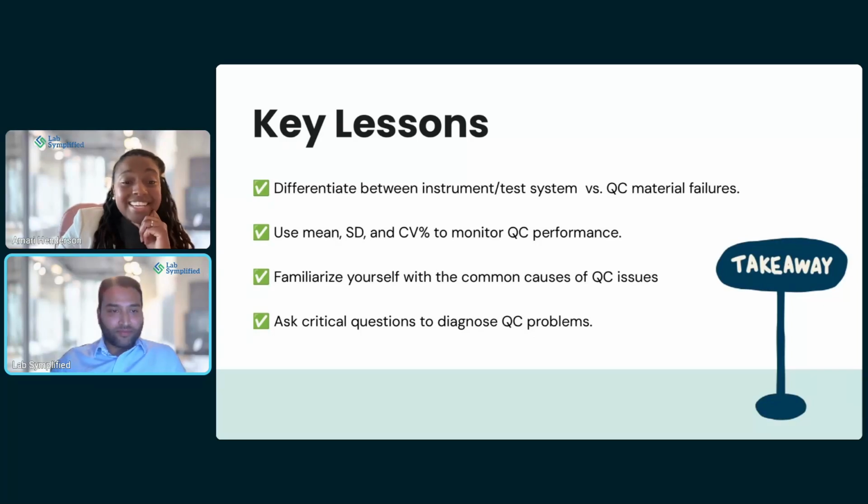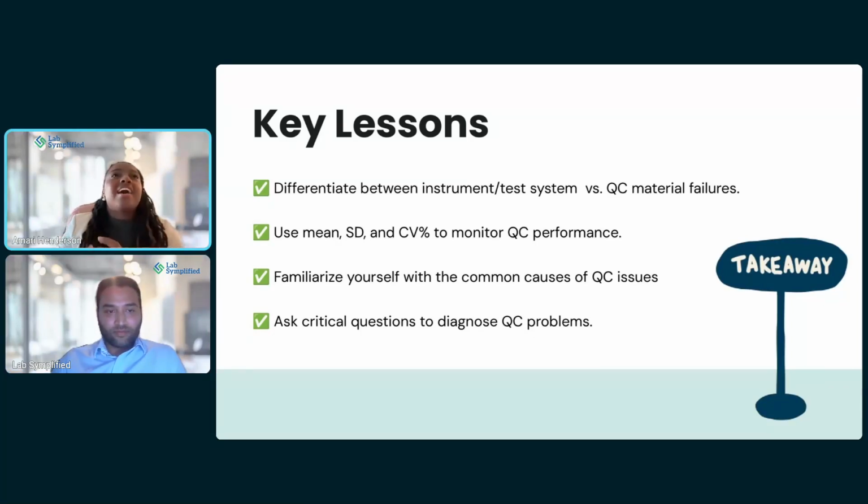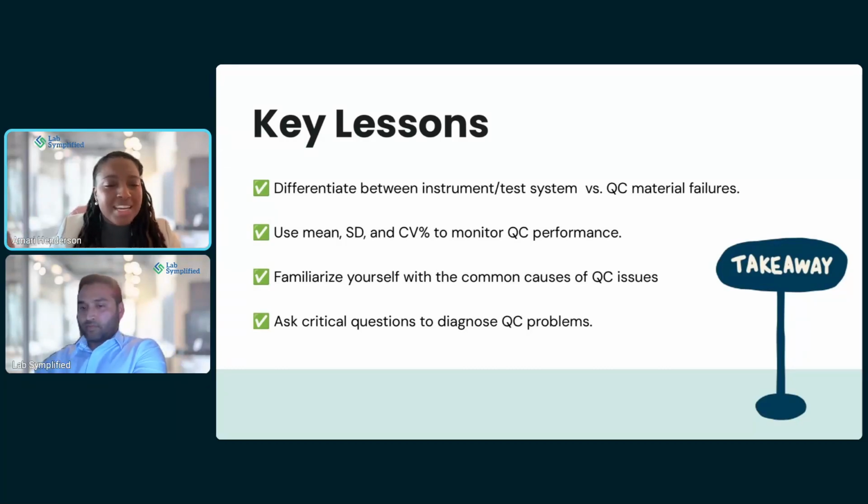That is extremely important. It's so important that a lot of times customers will call me and say, "Hey, what's my method?" And I'm like, I can't tell you your method. You literally have to, your instructions for use for your reagent is so important. You can even Google your assay IFU and look up your method from there.